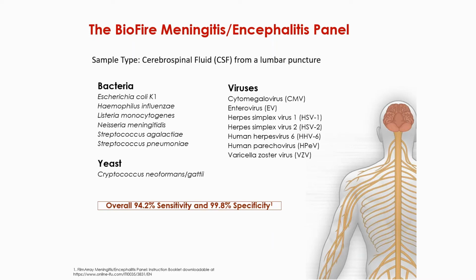As far as the sensitivity and specificity, we haven't found a situation where this hasn't given us appropriate answers. At least in my years of working with the ME panel, a situation has never occurred where the patient's ME panel was negative for strep pneumo, but then their blood came back positive for strep pneumo. Well, we haven't seen that. We haven't seen that occur. So the specificity has absolutely held true for us, as indicated here.